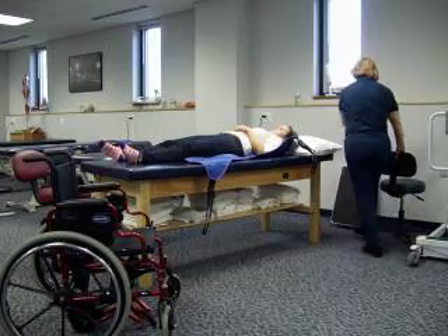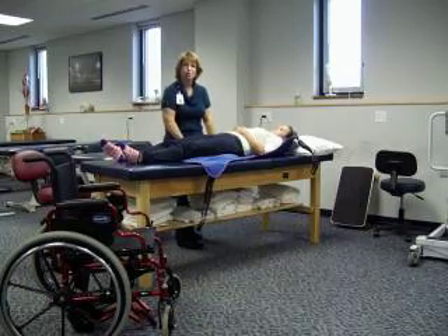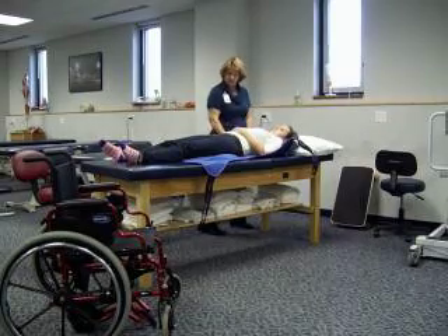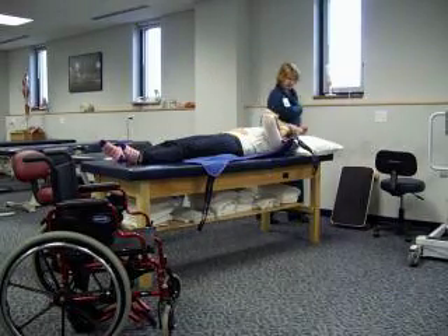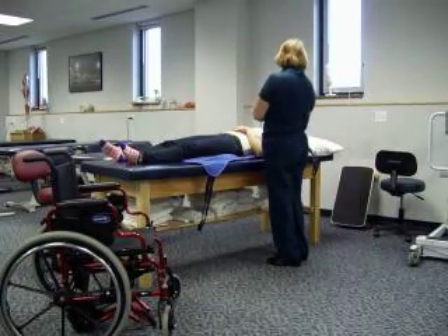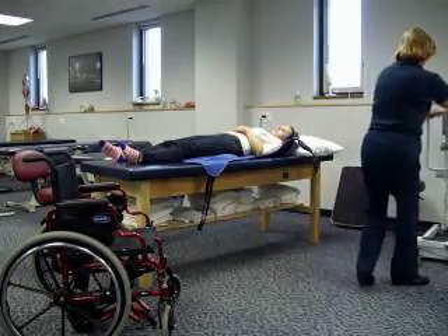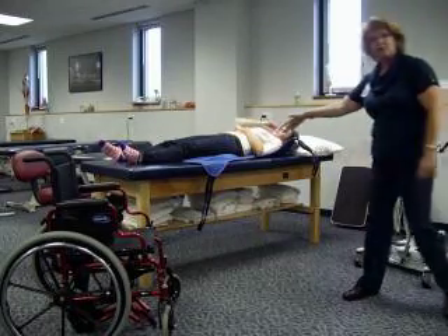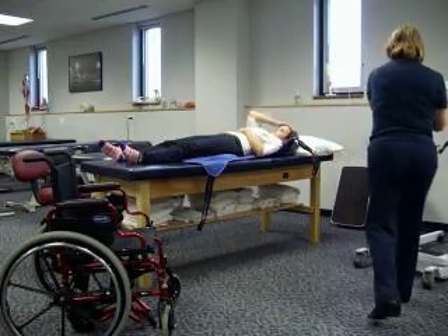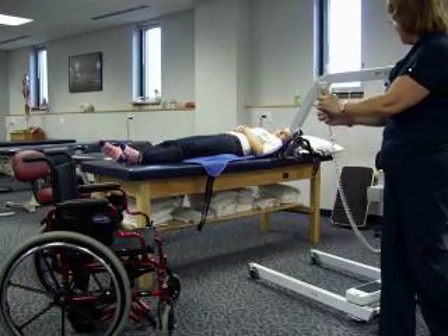I'm going to go around to the other side to see how even we are. If you need to do any pulling, make sure you're pulling and not trying to push. That looks pretty good. Is everything comfortable so far? I'm going to bring the machine over — when I do this I'm going to put part of it right across your belly. Everything's stable, so you don't have to worry about falling. You do have to do this with a table that does not have a metal leg down the middle because it won't fit. Let me raise this up — I have an up-and-down lever here.